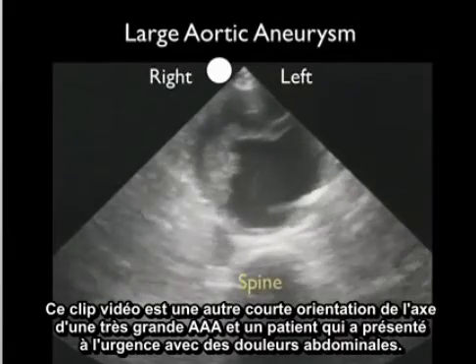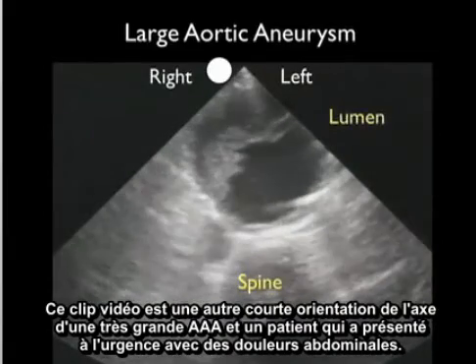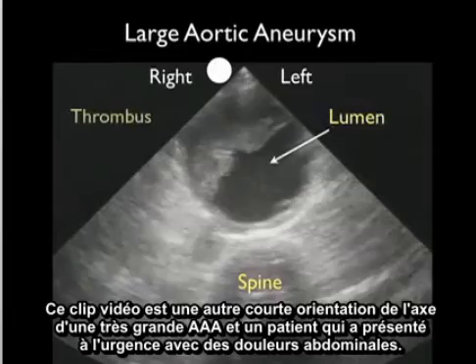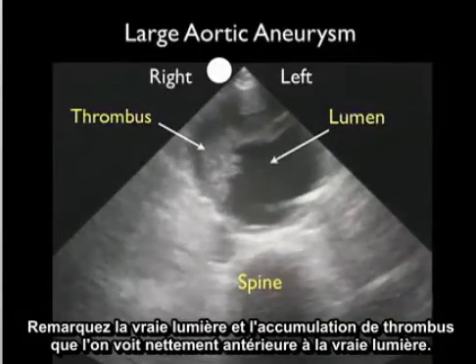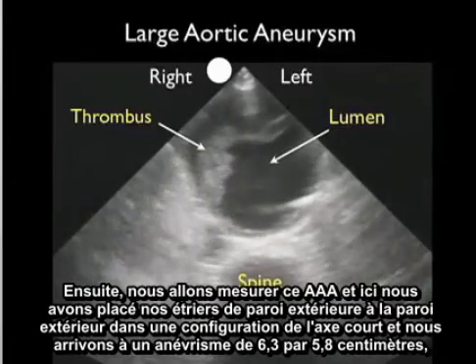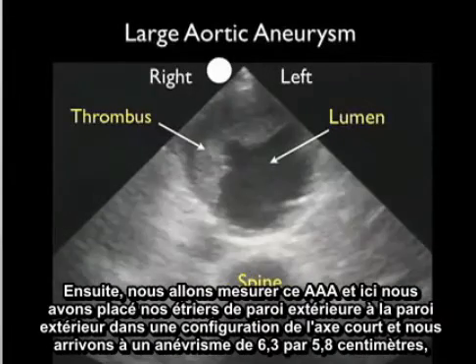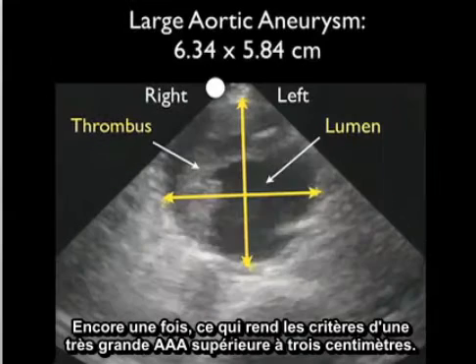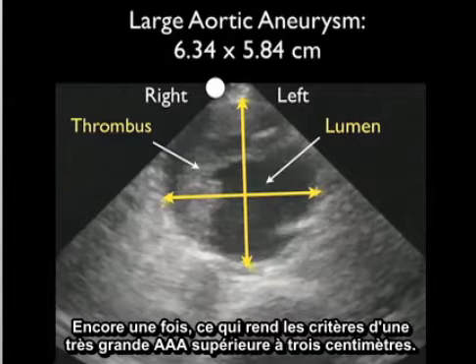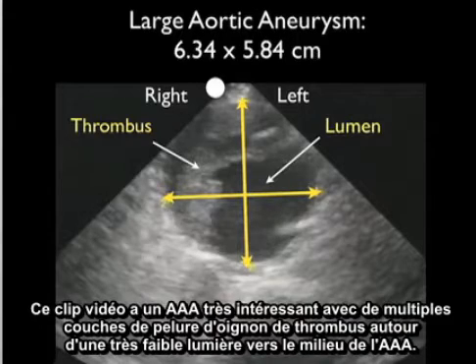This video clip is another short axis orientation of a very large triple A in a patient who presented to the ED with abdominal pain. We mark the spine as our landmark, and anterior to the spine we see a very large triple A. Notice the true lumen and the accumulation of thrombus substantially anterior to the true lumen. We've placed our calipers from outer wall to outer wall in a short axis configuration, and we come up with an aneurysm of 6.3 by 5.8 centimeters, again making the criteria of a very large triple A greater than 3 centimeters.